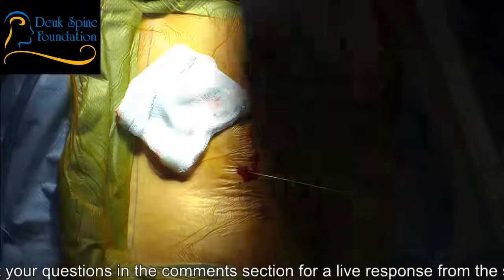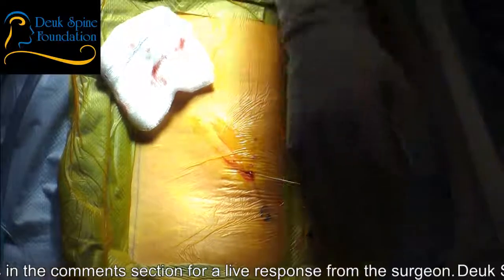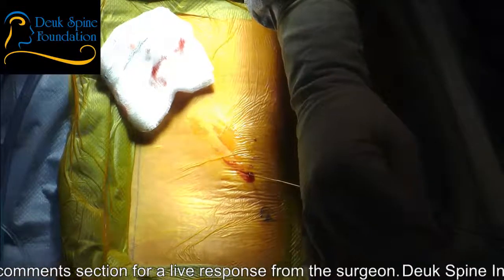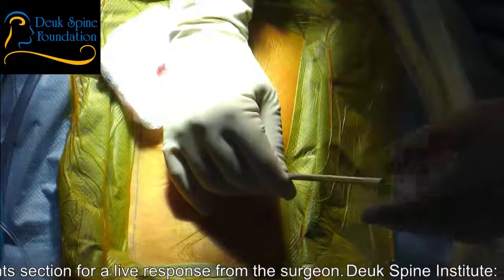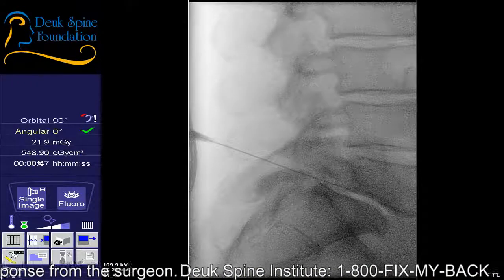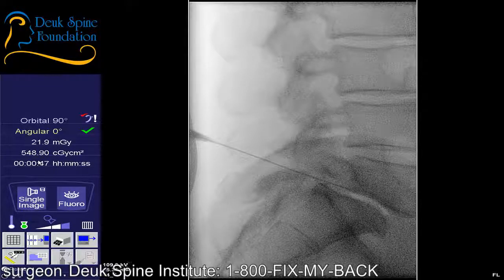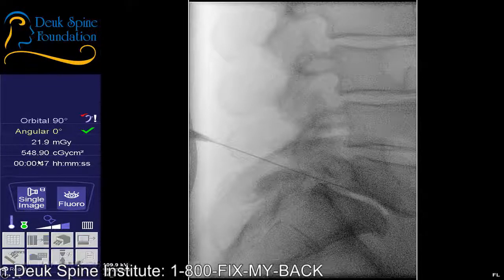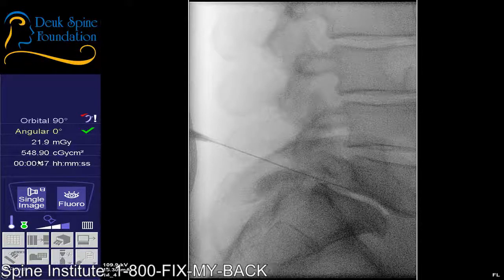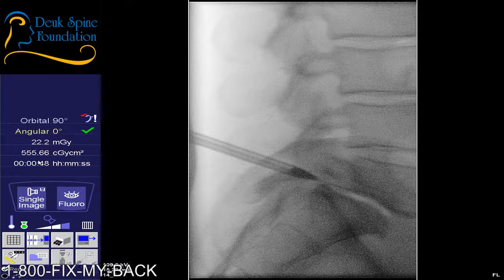Blood pressure is where? Can we get that down, please? Shot. So we use the guide wire to kind of get us down to where we need to be, but ultimately, shot. Come on, Jordan. I don't need to have you not doing the shots. This is where I need you to do the shots.